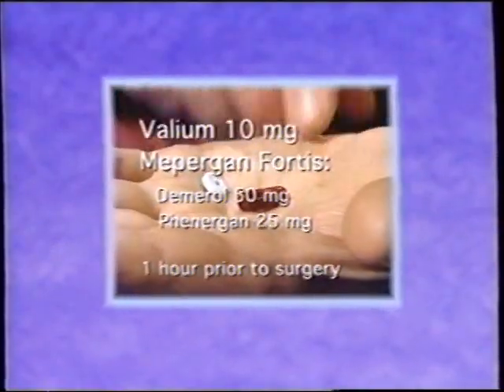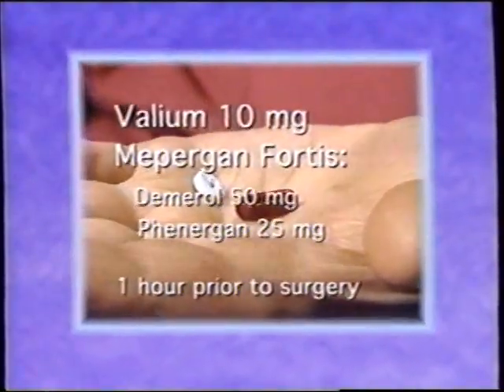These three drugs all have synergistic effects of sedation with the patient. Put the 301 down there as far as we can get it. We got part of it there. Squeezed on the tooth and infection came out of the nerve chamber. We need to make sure that after we do this, we profusely irrigate. It's loose as a goose, and there it is. Okay, that's great.